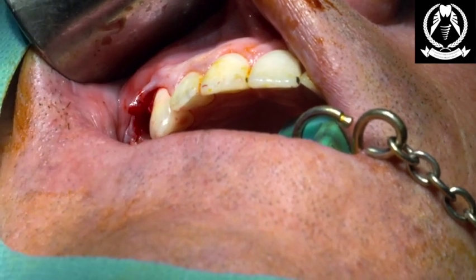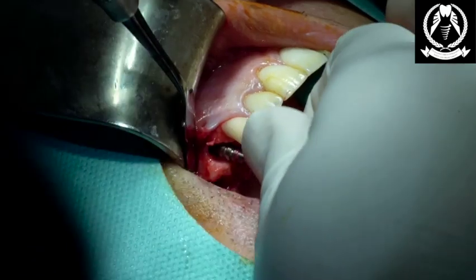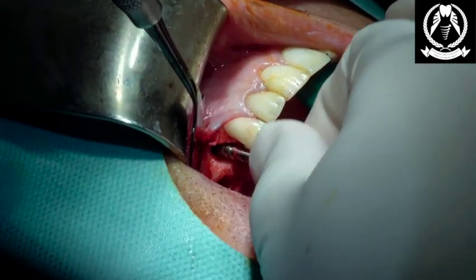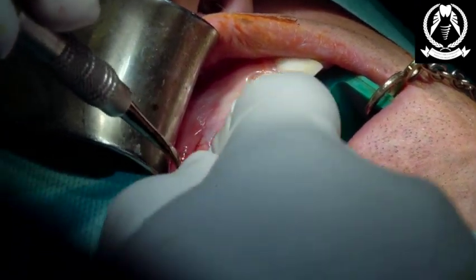Yeah? Directional indicator. Open for me, Alan. First implant's in, buddy. Okay. Are we all happy with that? Okay, I'm just going to put the directional indicator on. I'm quite happy I'm away from the root of the canine and I'm going for the sinus lift at the back now. Really simple.